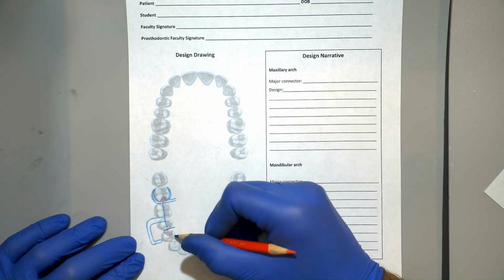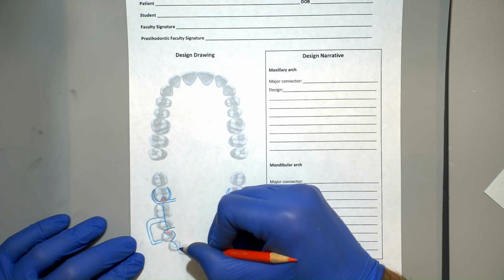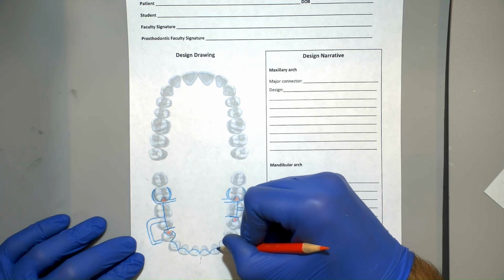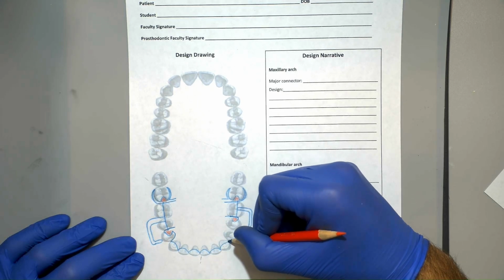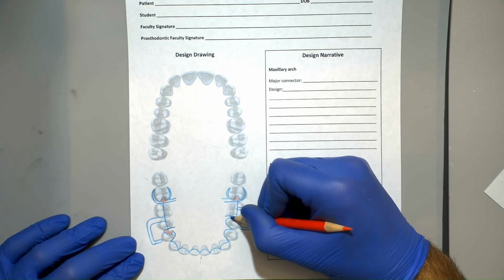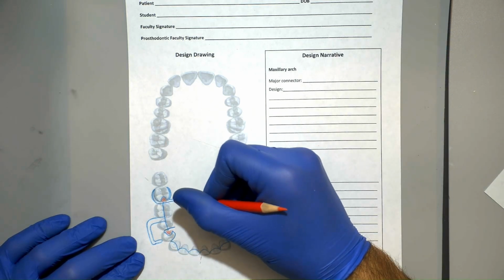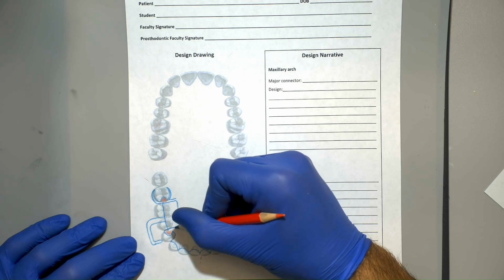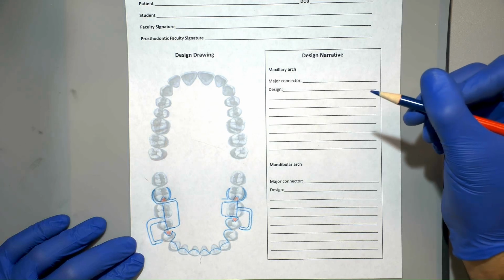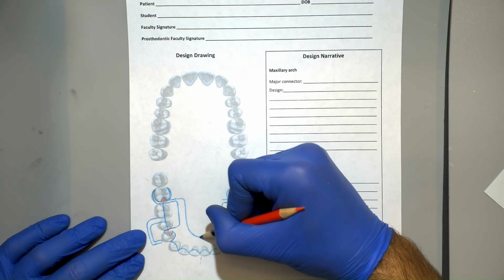Now let's start the lingual plate. To do that on premolars, we're going to go around the lingual outline. But then on anterior teeth, we're going to go from one proximal contact to the other, draping over the cingulum and going to the next tooth, like this. And then transition to the premolar around the lingual and into the other rest. Next, we're going to go ahead and connect both lines of the minor connector that are adjacent to the edentulous space. And to finish off the major connector outline, we're going to connect the remaining lines on the outside of the minor connectors to each other.